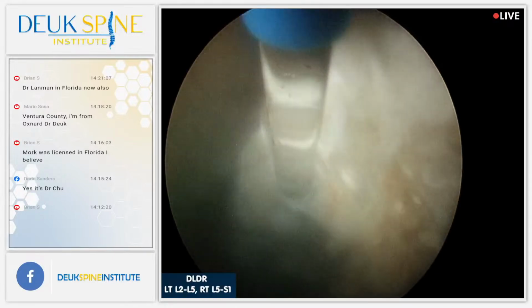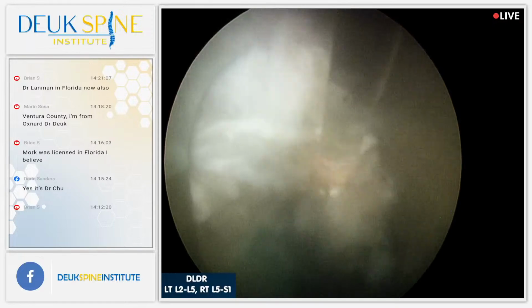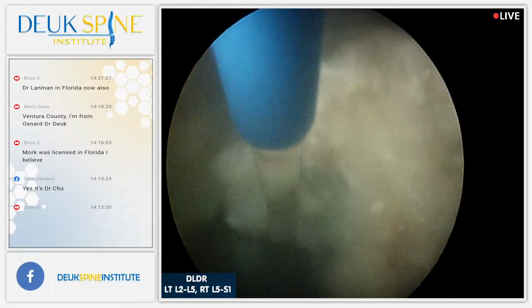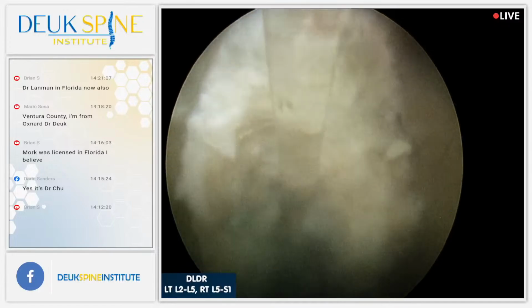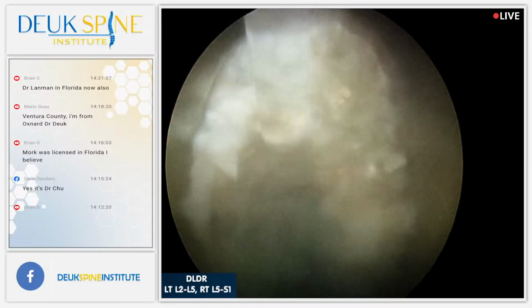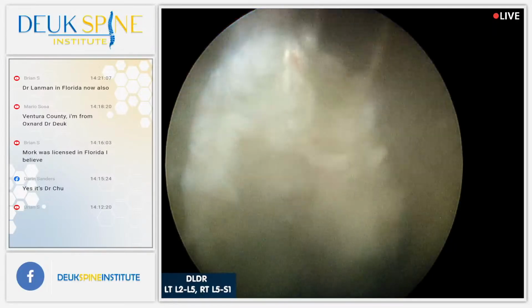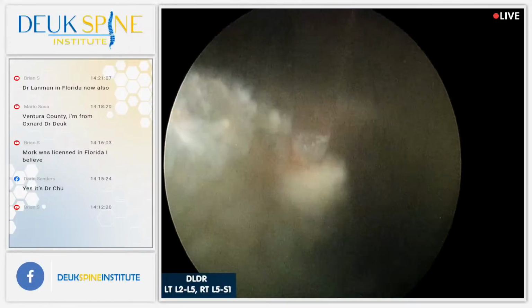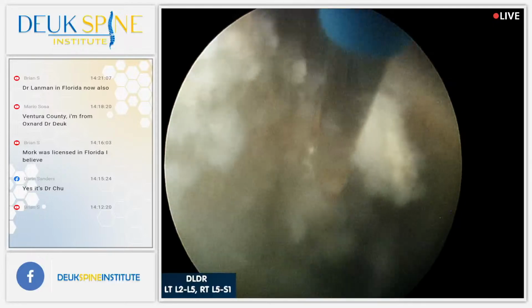All right, we are once again at the apex of the herniation. That's the farthest back part, and we're just cleaning up this tear, the annular tear, getting rid of the interposed nuclear material. Some scar tissue right here, the white stuff. The orange stuff is calcium, and the gray thing on the sides is my tube. You can see the little scratches on the side of the tube.